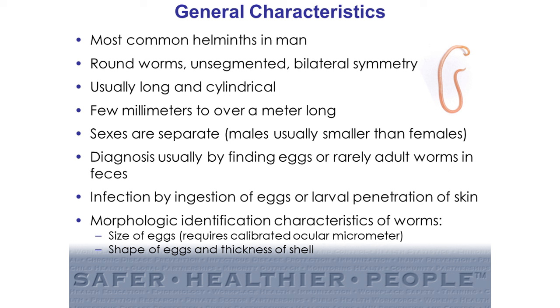An exception to finding the eggs in feces is with the Strongyloides, where the eggs hatch in the intestine and only the larvae are recovered in stool. The case of pinworm also deserves some mention here, in that eggs are rarely passed or recovered in stool. A special technique, the scotch tape, is required for the diagnosis of pinworms.